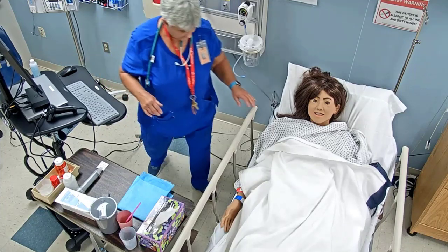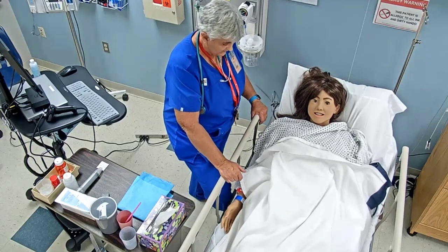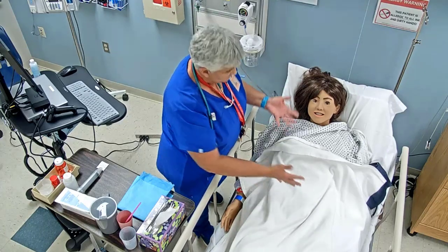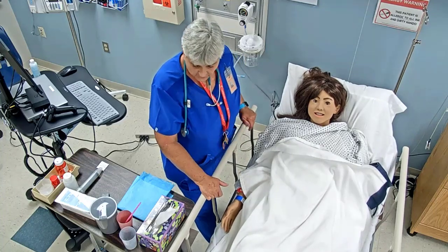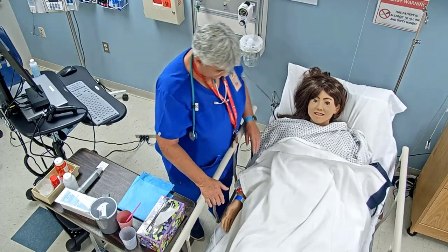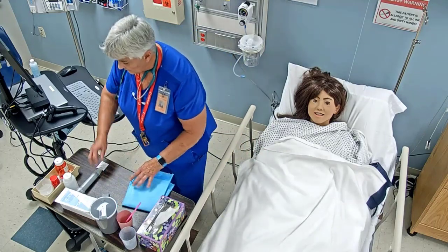So before I leave, I want to make sure I put the bed in the lowest position. Oh, you know what? I didn't get it up there, but you're high enough that I didn't really need it. But I would have raised it if I needed to, but we were right here. You were actually with this bed the way it is. But make sure the bed's in the lowest position, side rails up ×2, and the wheels are locked, and we've got our call light within reach. Okay. And I've got everything cleaned up.